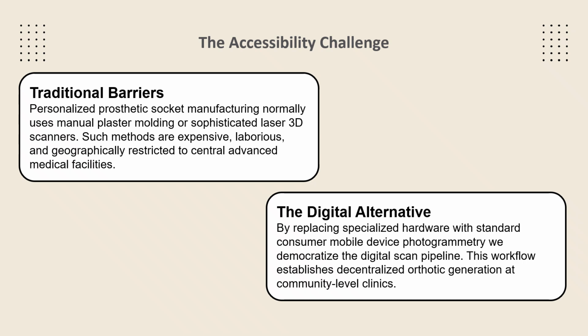Understanding the context of this study starts with the accessibility barriers of the global prosthetics market. Standard clinical workflows for custom personalized prosthetic socket manufacturing use manual plaster molding or sophisticated high-end laser 3D scanners.